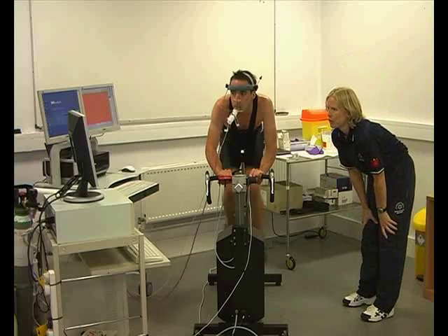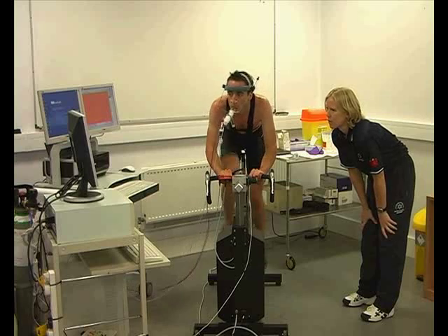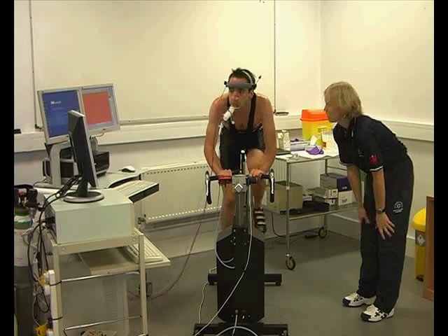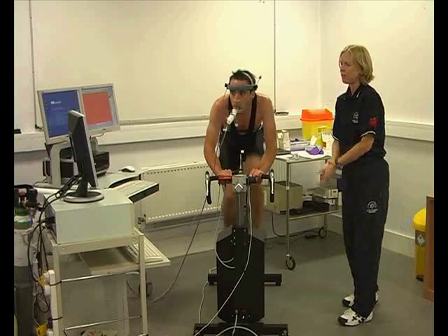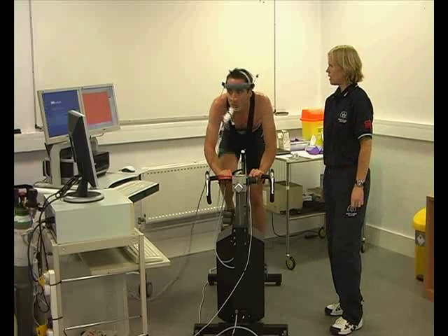It's now all about giving the athlete as much encouragement as possible, just trying to get the power output as high as they possibly can. He's focused on the screen, trying to keep his cadence high — he knows the end is in sight. Excellent stuff.